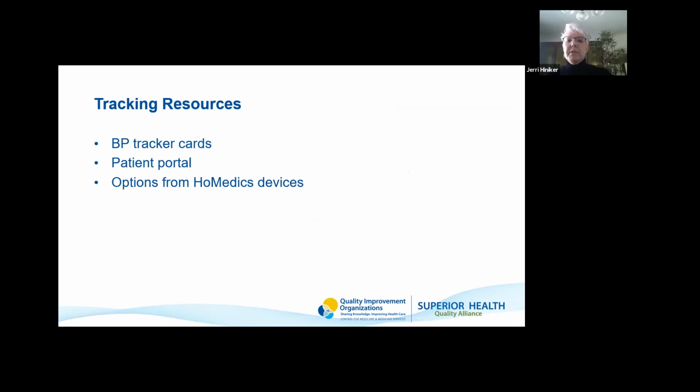So also, these were just some of the resources. I know we talked a little bit about some of these last week, but we're talking about BP tracker cards that you can use, patient portal. There's also options from Homedics devices because they have their own tracking within the device. So just kind of wanted to remind you of that.